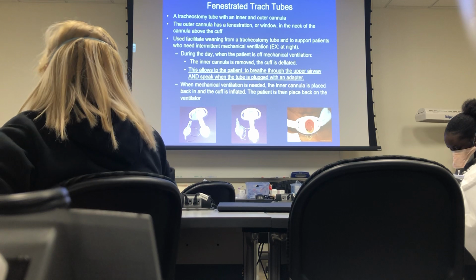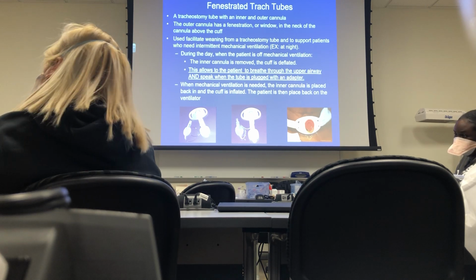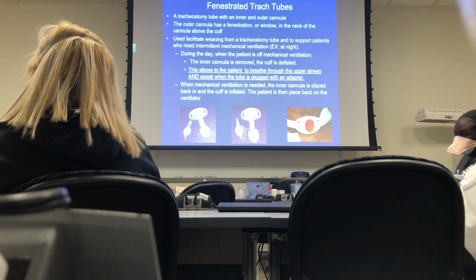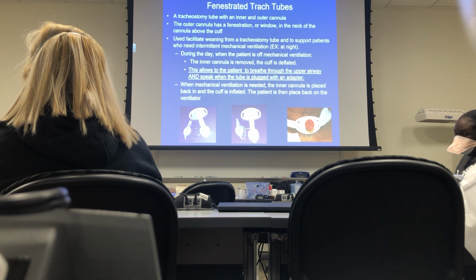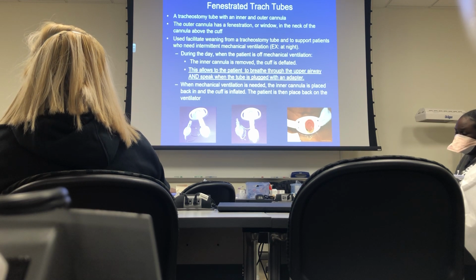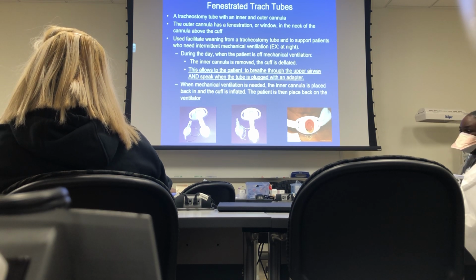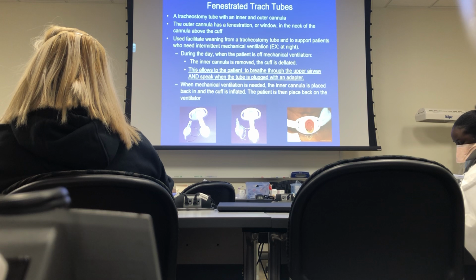So the trick on an exam is to understand there has to be a way to do this. Suction, deflate the cuff. Never put the plug on there until the cuff's deflated. Okay, because then they won't be able to breathe. Got it? Okay. All right, so let's look at the PowerPoint.